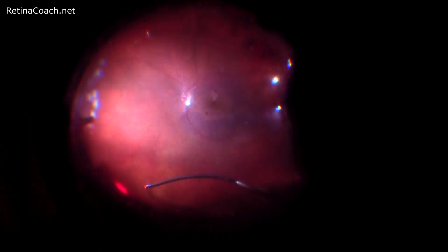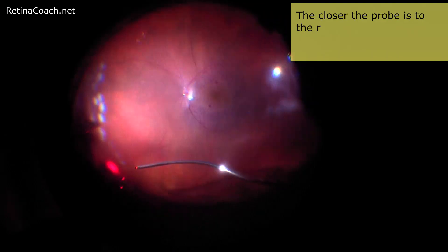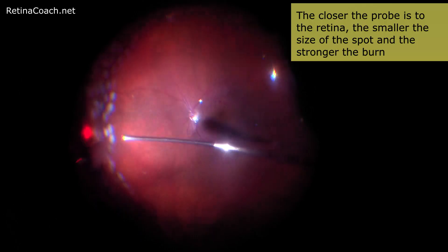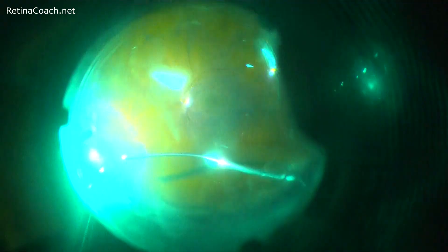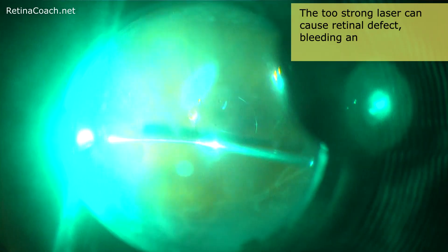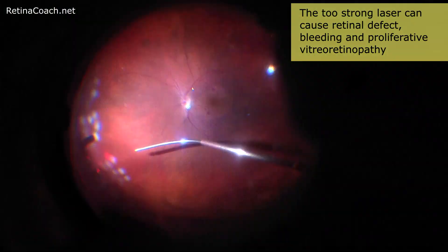The size and strength of the laser burn also depend on the distance of the laser tip from the retina. The closer the probe is to the retina, the smaller the size of the spot and the stronger the burn. Too strong a laser can cause retinal defect and bleeding.